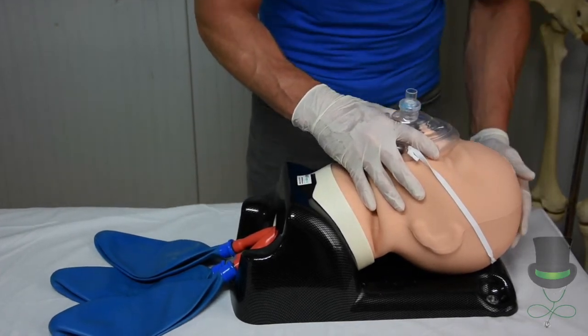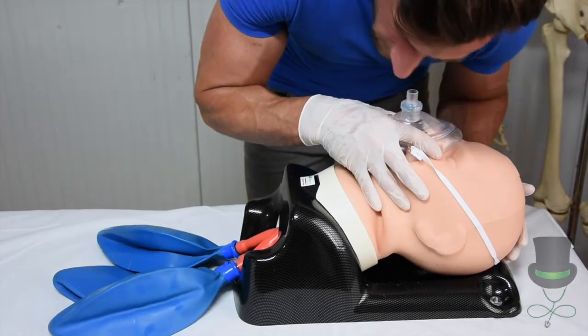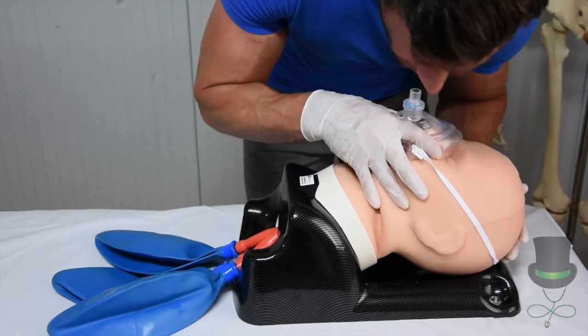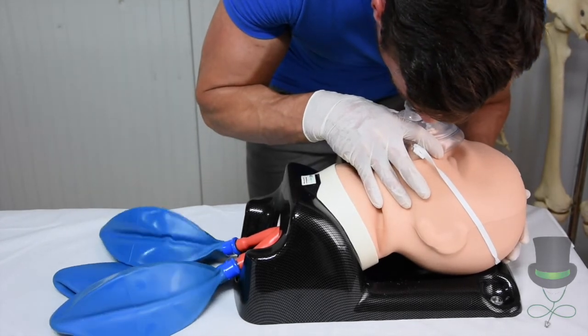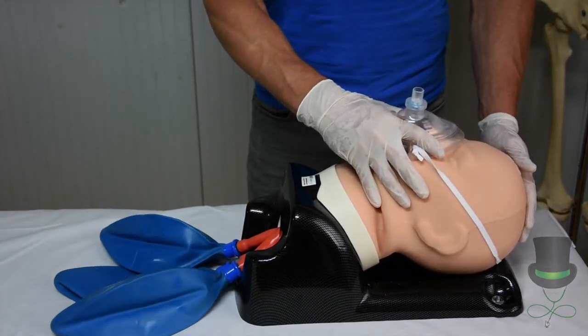Next, provide ventilations, ensuring that you can see the rise and fall of the chest.